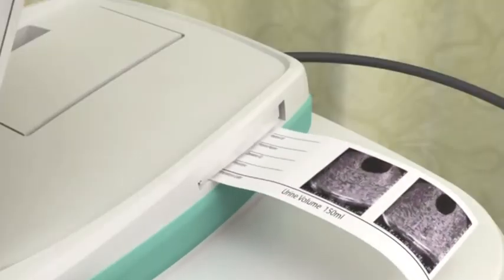When you have verified an accurate scan, the screen will display your results. Wipe the gel from the probe and the patient. At this point, you may record a voice annotation to save your exam, print the exam result from the onboard printer, listen to previously recorded annotations, or review data from saved exams.